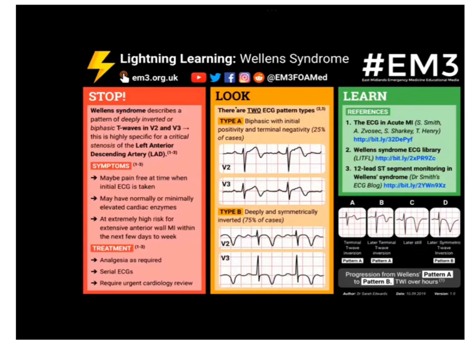In Wellens syndrome type A, we get biphasic T waves in V2 or V3 — initially positive, then negative. This is highly specific for critical stenosis of the left anterior descending artery. The patient may be pain-free. Treatment includes analgesia, serial ECG monitoring, and cardiology review.